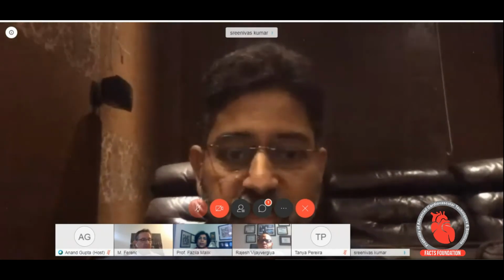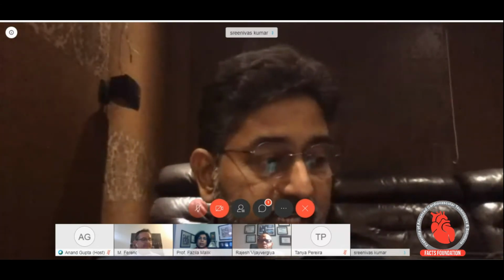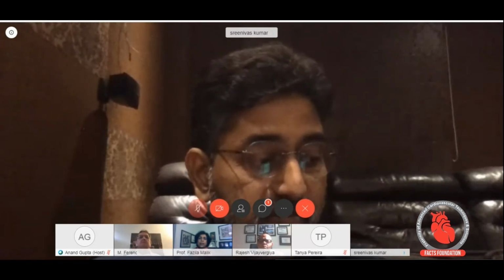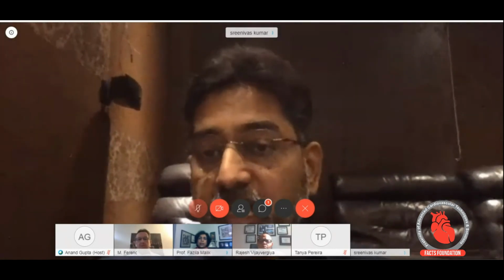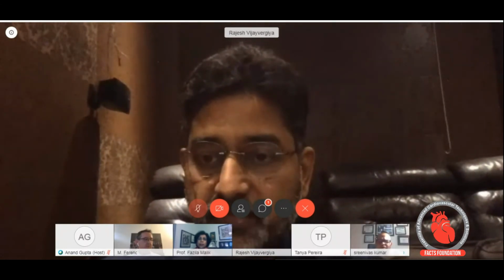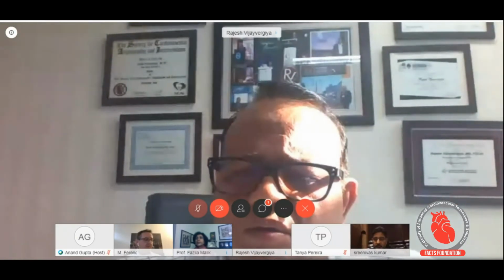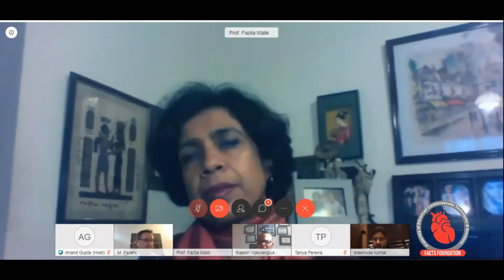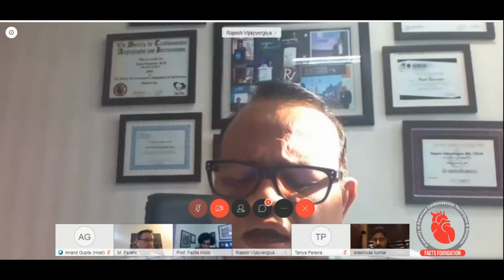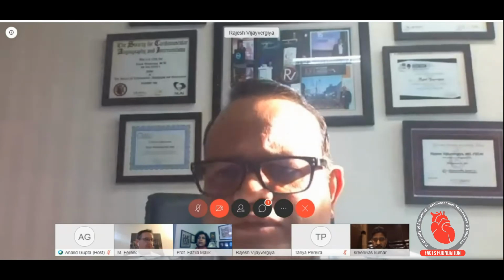One most important question I would say is asked regarding diameter assessment of stents. Are you using minimal luminal area, media to media, or intima to intima? I think this varies with imaging. I think Professor Rajesh would like to take that. So it's the external elastic membrane for the OCT, for minimal luminal area and vessel diameter. So it's the external elastic membrane, and the same extent for media for the IVUS.